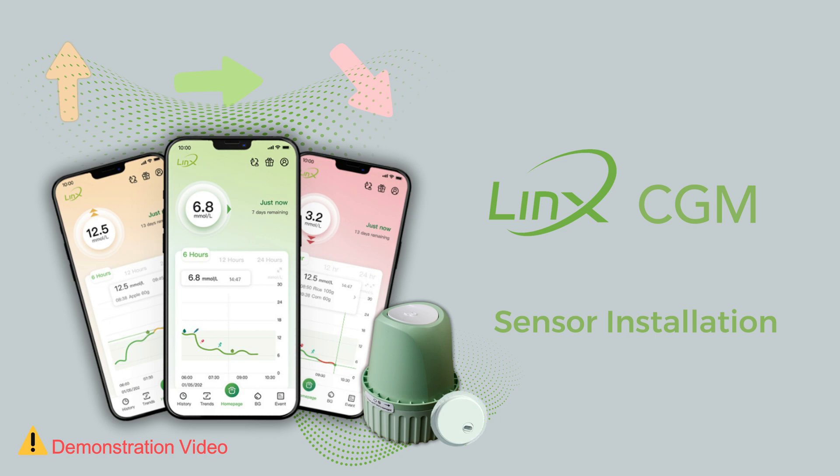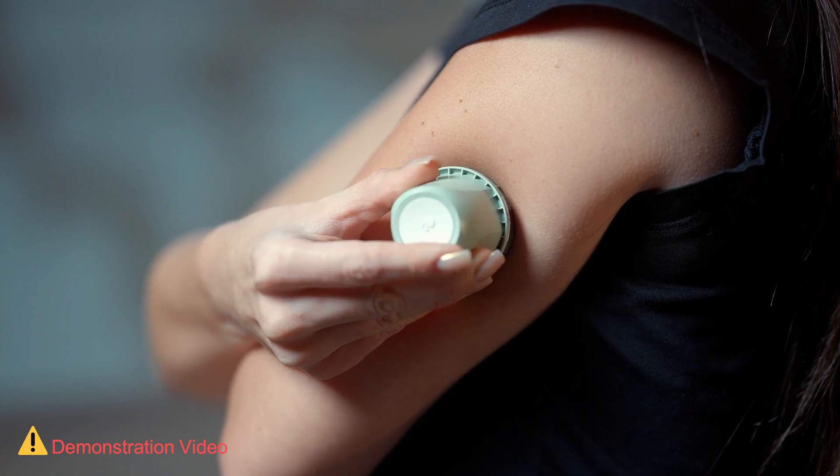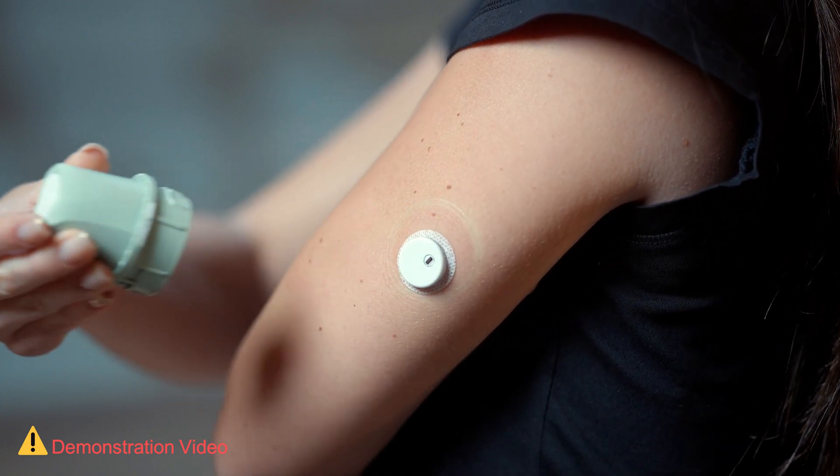LINX CGM Sensor Installation. In this video, you will learn how to install the LINX or 8XX sensor.